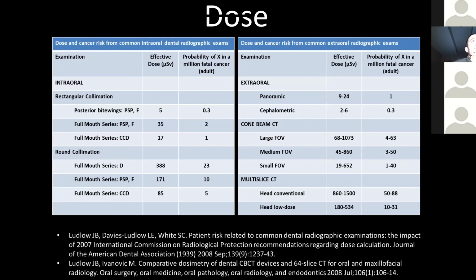Okay, let's see. Do you have any idea what percentage of general dentist DDS practices have cone beam CT units? I don't right now. I've tried to get that information and don't have it at hand. It's a moving target. What I can say is that cone beam CT is here to stay for a while. It's just become too integral to many different practices and specialty areas of dentistry to go away. So that's why I really advocate for, even if you don't have one in your office, being comfortable opening one up and working through it. And we can build on that discussion next week.